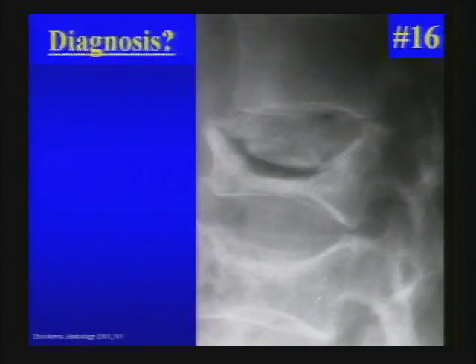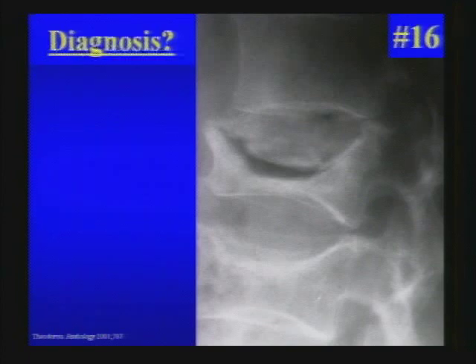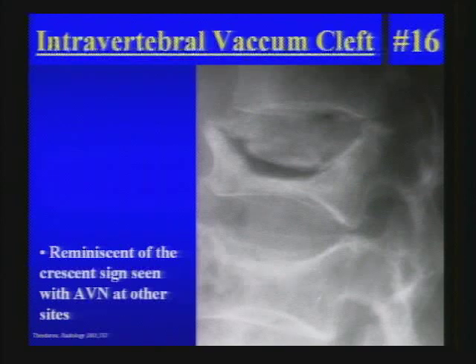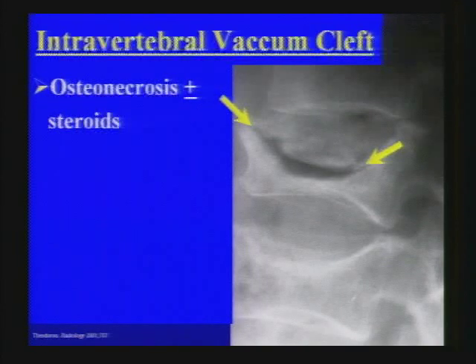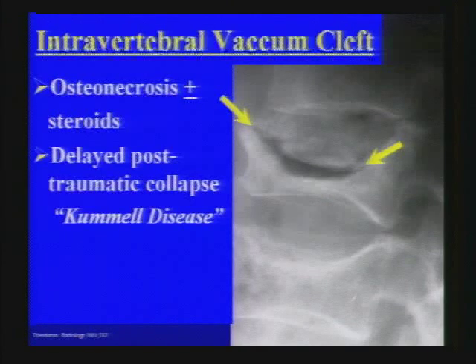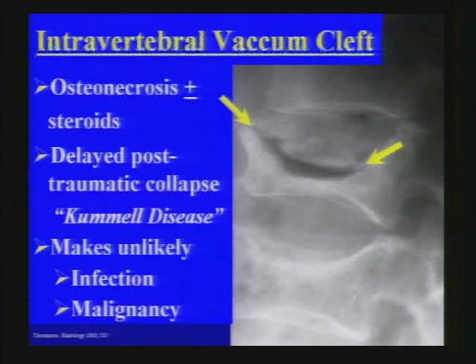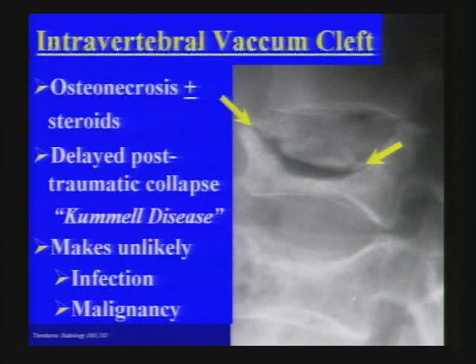Next — an intravertebral vacuum cleft within a flattened vertebral body. It is not stippled like a gas-forming infection; rather, it is an intravertebral vacuum cleft reminiscent of the crescent sign seen with AVN at the femoral and humeral heads. This is typically considered either a sign of osteonecrosis — as might be seen with steroid use — or in the setting of delayed post-traumatic collapse, termed Kümmel's disease. Importantly, when you see it, infection and malignancy are unlikely, as those conditions are associated with positive pressure. The vacuum cleft becomes more prominent on extension imaging.